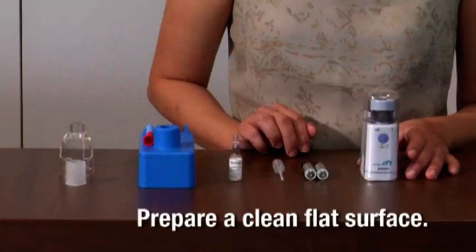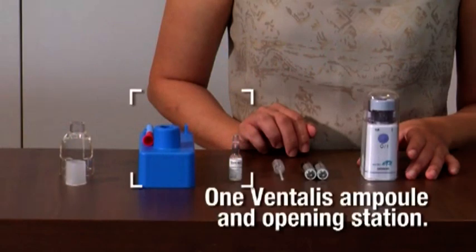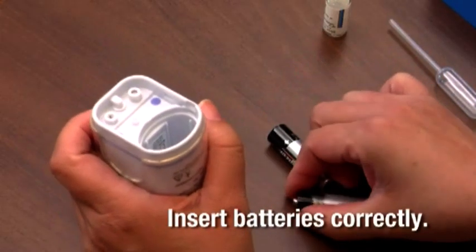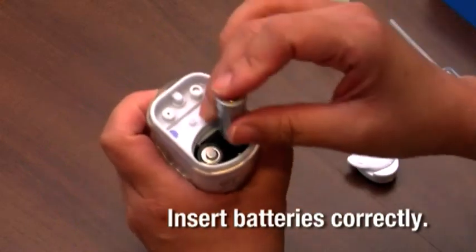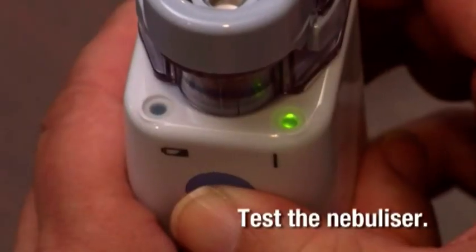Prepare a clean flat surface to set your nebulizer. You should have the nebulizer, one Ventivis ampoule, the opening station, and a clean pipette. First, ensure that the batteries are in the nebulizer and insert the batteries correctly. Test that the nebulizer is working.